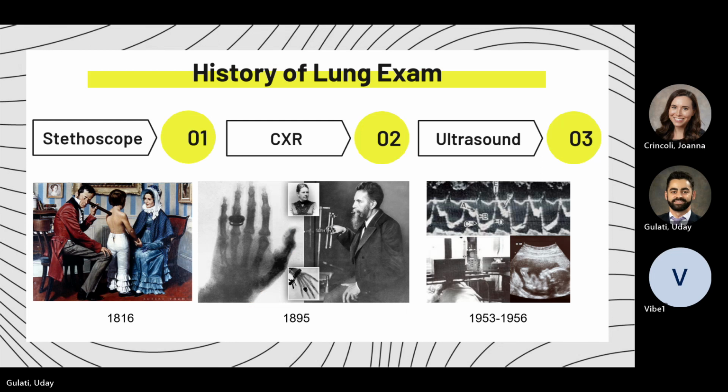And so, really going back, this is not meant to be a lecture, but credit is due where it's due. In 1816, do you know who made the first stethoscope? Bit of history. It's René Laennec out in France. What he did was something as simple as taking a long paper tube, rolling it, and using it to funnel the sound from a patient's chest to his ear.